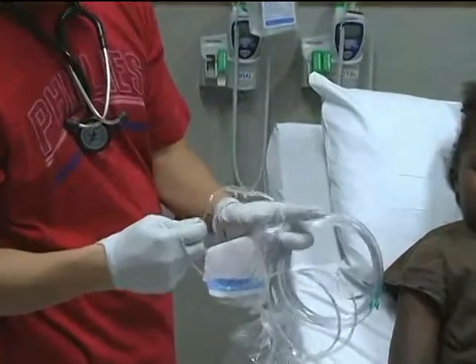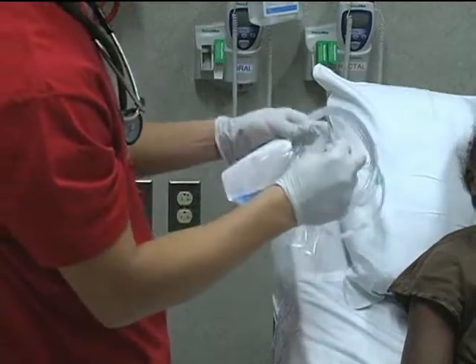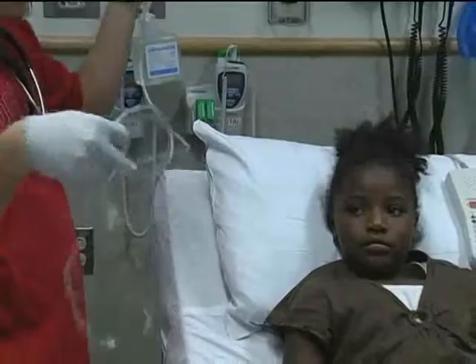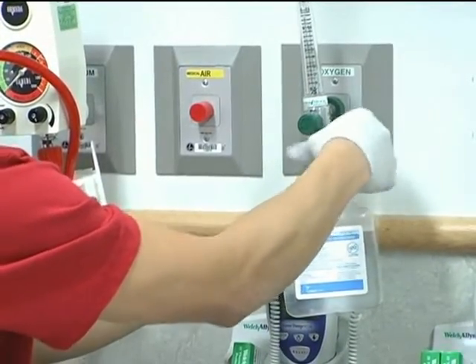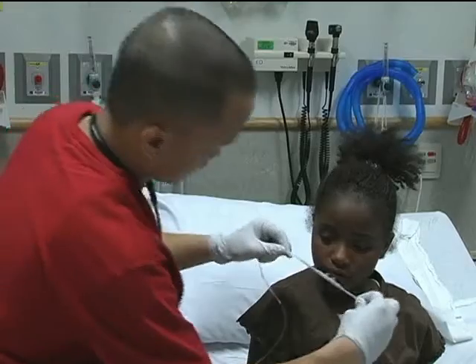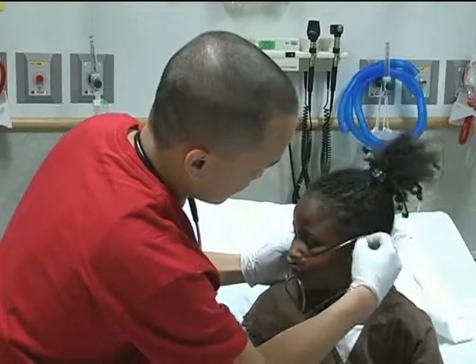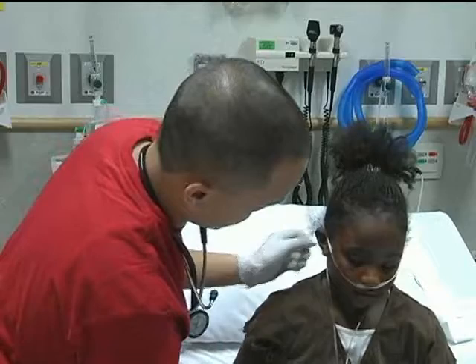A nasal cannula is able to deliver a low flow of oxygen through two small prongs placed underneath the nares of the child, with the other end of the tubing connected to a continuous oxygen source. Here we see continuous humidification, which is given for any patient receiving continuous oxygen via nasal cannula to prevent drying of the nares. Nasal cannula prongs are carefully placed underneath the nares, and tubing is secured around the ears and fitted with an adjustable strap.